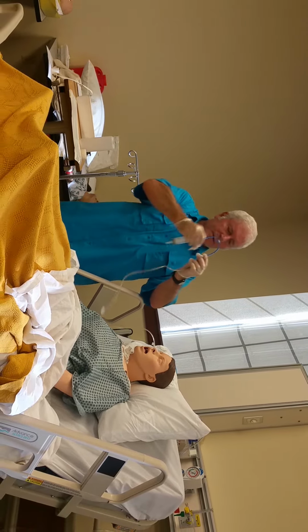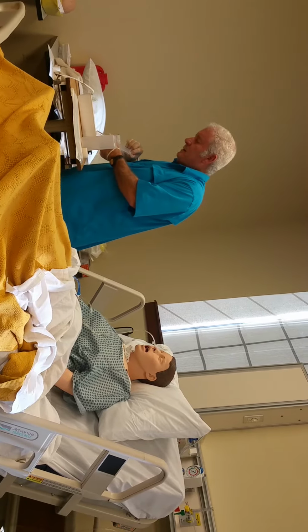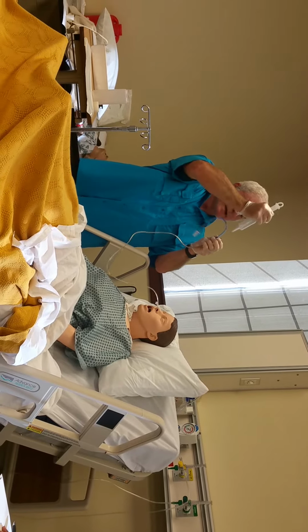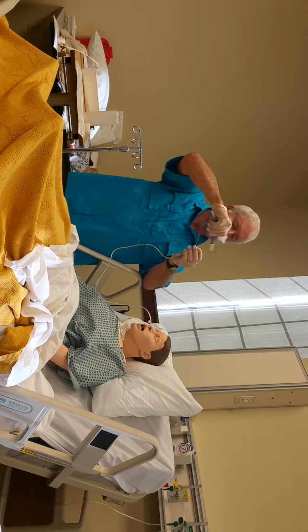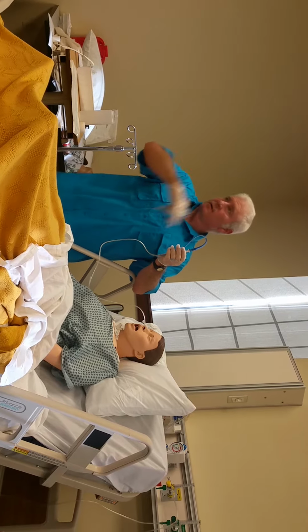Then I can clamp this if I need to. Whatever I put my 60 in, I pull my 60 back out. Put that in there. And now I'm ready to feed, okay? The book says if it's like 100 or less, replace it and go ahead and do your feeding.